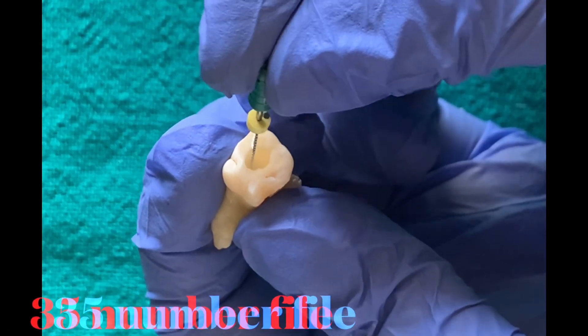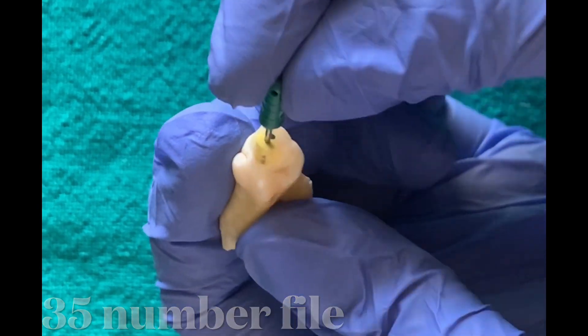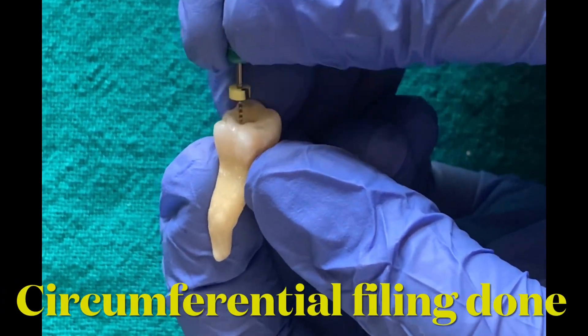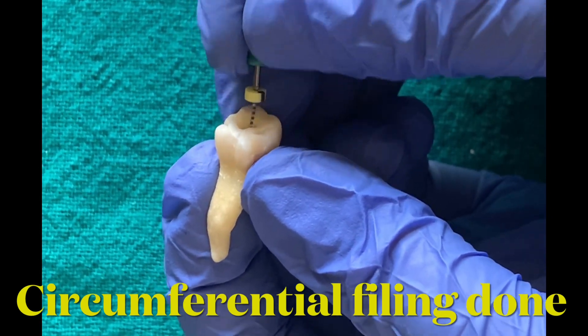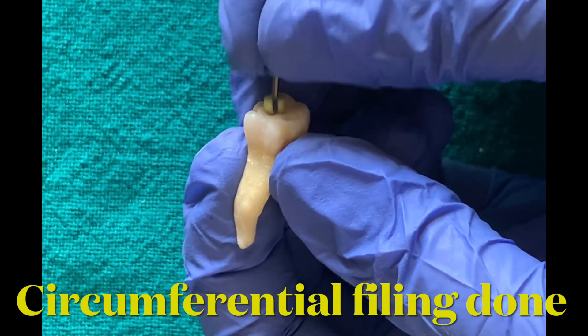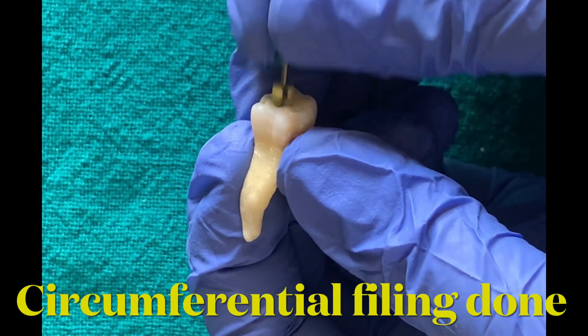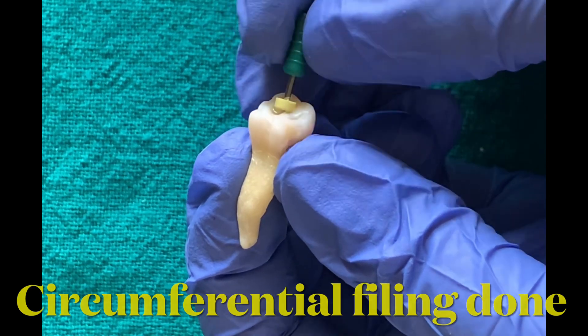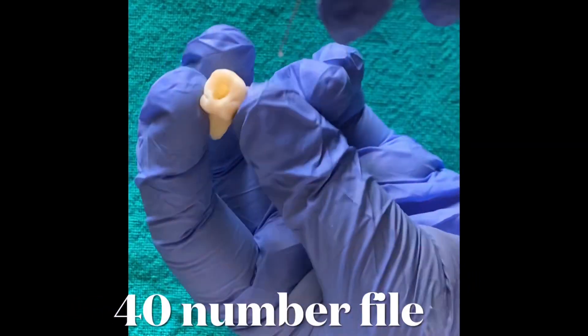The number 15 file is inserted in the coronal portion and circumferential filing is done, in which the file is moved all along the walls of the canal in an up and down motion. This is done to enlarge the coronal one-third of the canal. This step is done because the canal is narrow and partially calcified.